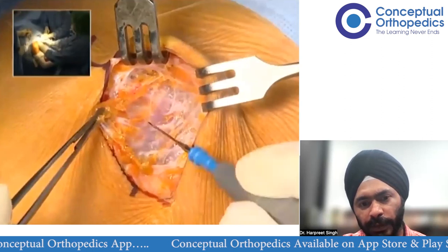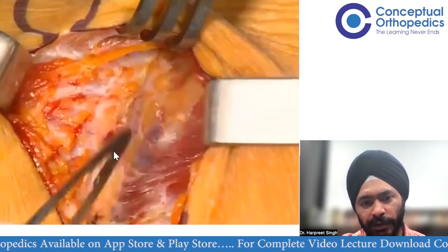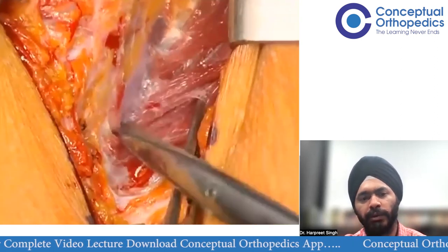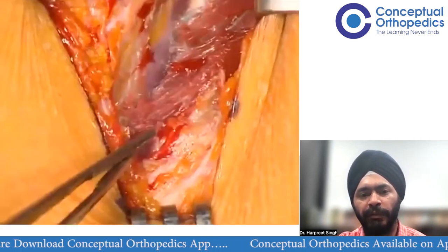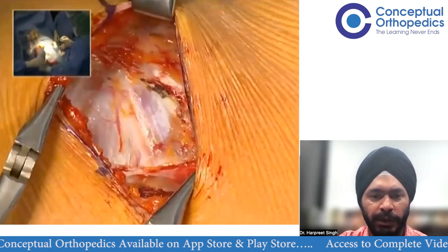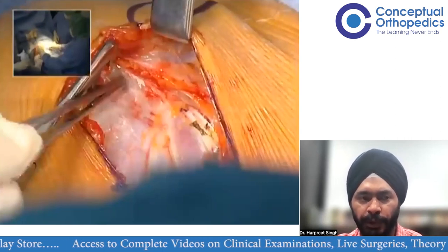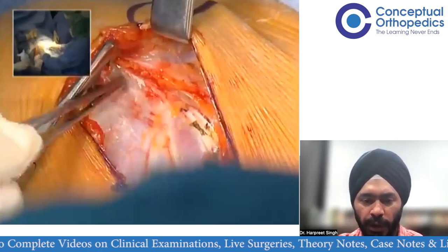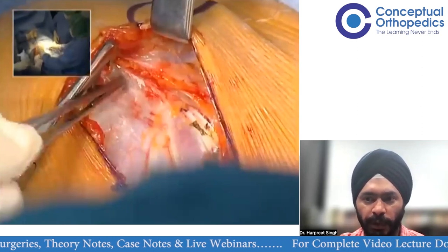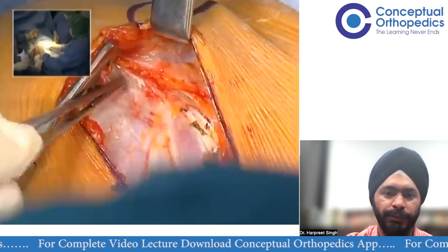Dissect in the same plane as your incision and look for the deltopectoral interval, which is marked by the cephalic vein. The cephalic vein becomes apparent here — this is the deltopectoral interval. It's not very superficial; there may be some fibers of the deltoid or pectoralis overlapping the cephalic vein. Usually, you take the cephalic vein laterally along with the deltoid, because many tributaries from the deltoid feed into it. If you take it medially you'll have to cauterize many of those branches.